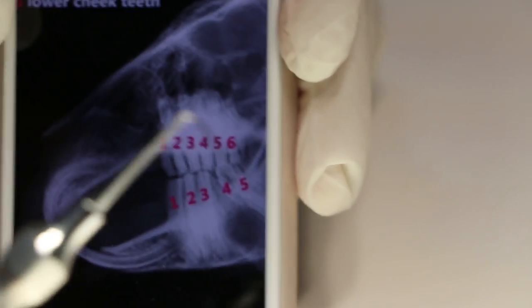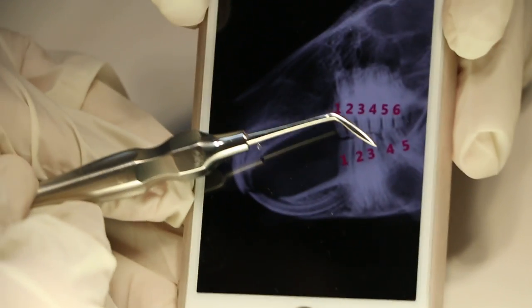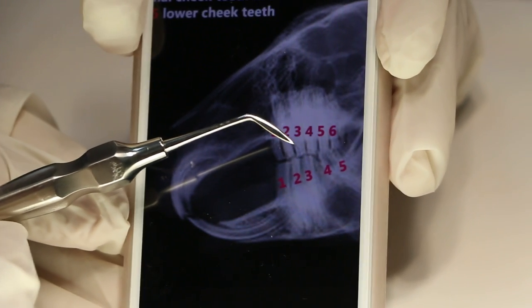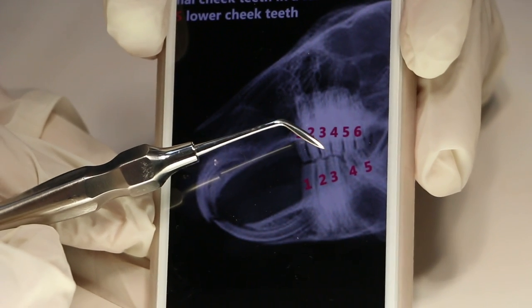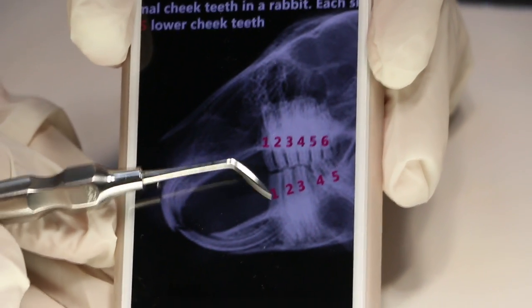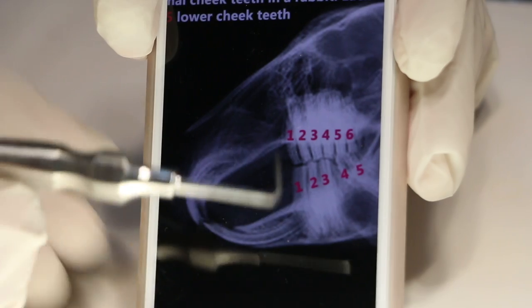Number four is the molar luxator — two-sided and mini. It goes inside the mouth and tries to loosen the ligament of the molar between the gums and the tooth. One end is for the lower molar and one is for the upper molar.